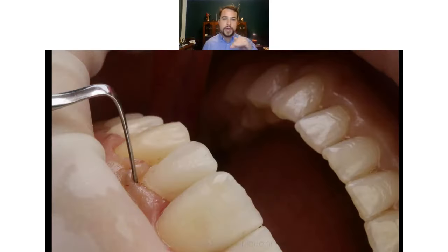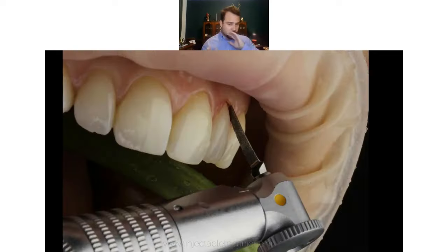You can help yourself with the Heidemann spatula or a specifically designed instrument, Zekrya. I think we don't have it here today in the presentation, but it retracts the gums and protects them while polishing the margins. And then if you have these polishing cones from Intensiv or EVE, Kerr, and so on, you can use them for polishing of the papillary area. Super useful instrument because it doesn't have a cutting edge.